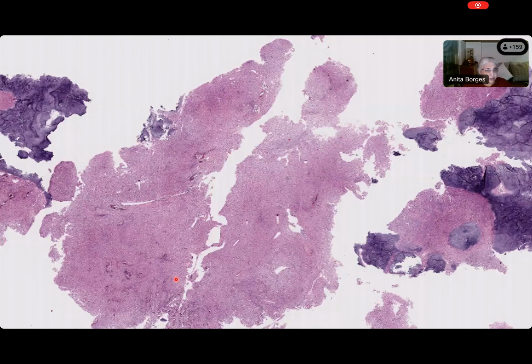Because I have seen enough tumors, enough lesions, if you give me a good description, I would be able to make the diagnosis. Now when you're saying, I'm seeing hypercellularity, it's not a good description. So tell me what you see. I am blind. Now you tell me. What are you seeing at low power? You start. Ma'am, I am seeing.